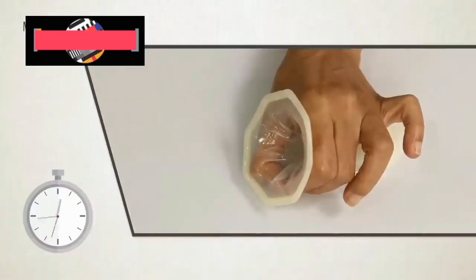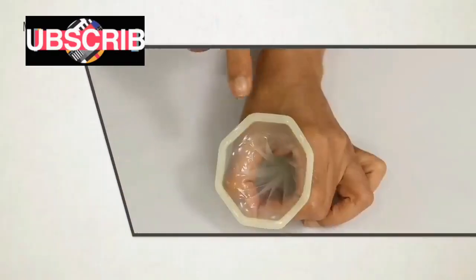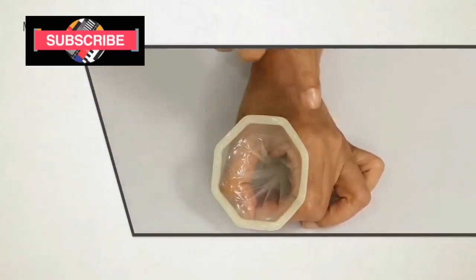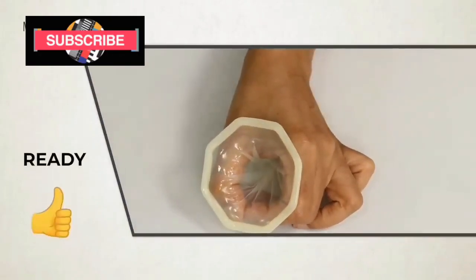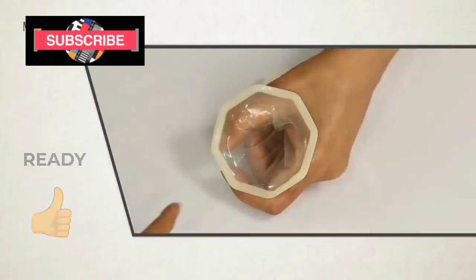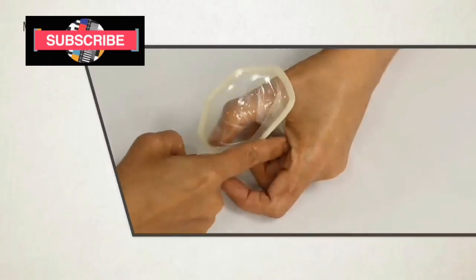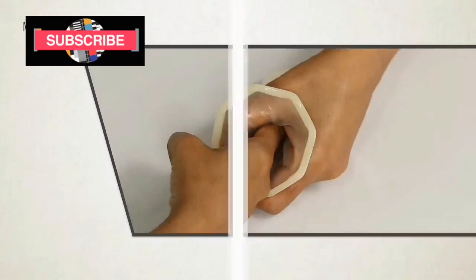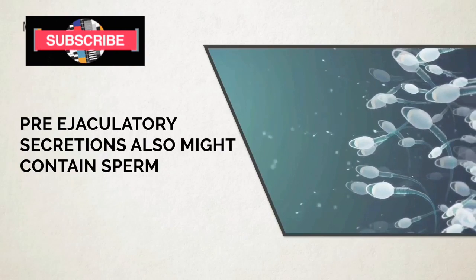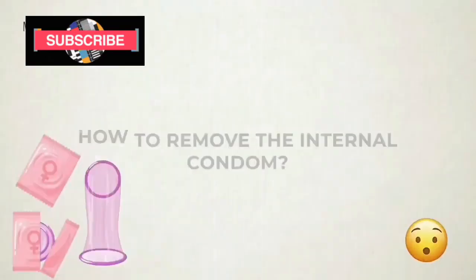It can be inserted up to 8 hours before the intercourse starts. Make sure that the outer ring covers the opening of the vagina and covers the surface as well. Make sure that the penis goes inside the female condom and not in between the condom and the body or by the side of the vagina. Make sure that the penis does not come in contact with the vagina before the female condom is inserted. Remember, pre-ejaculatory secretions might contain sperm that may cause unwanted pregnancy.